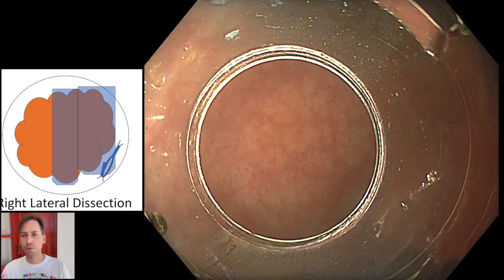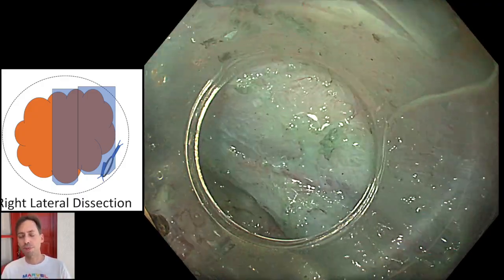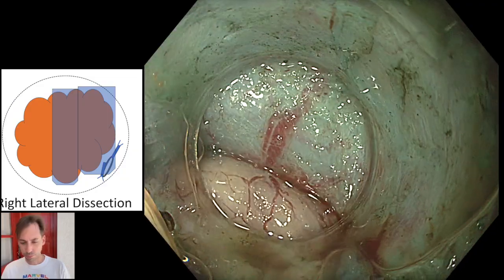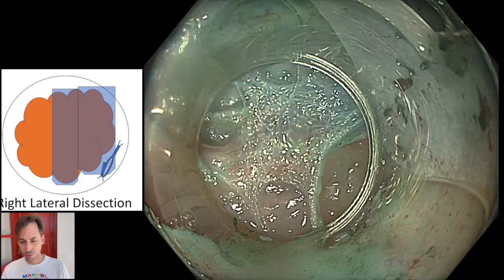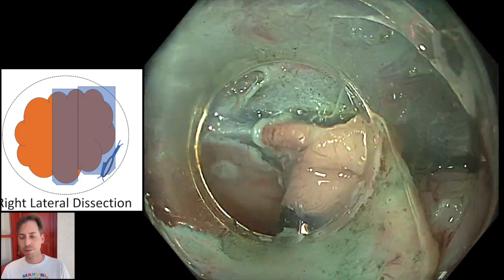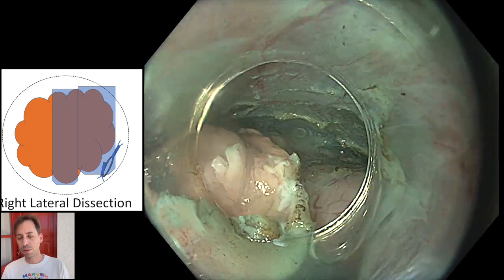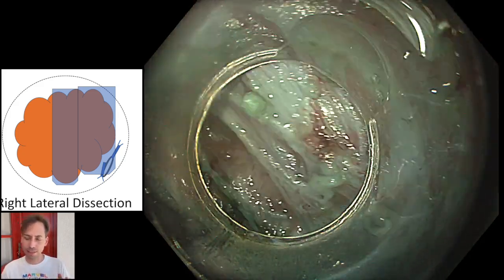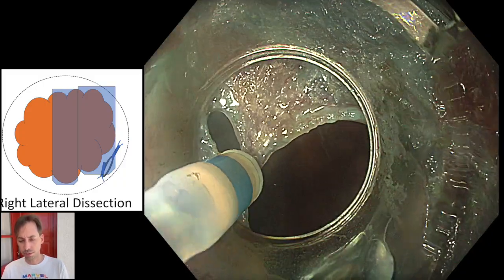All this has to be automatic without a lot of thinking, but it comes with experience. Here we reach the end of our, not exactly tunnel, but our dissection plane at the right side.